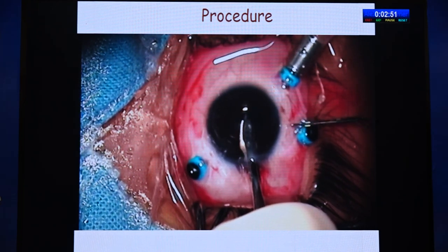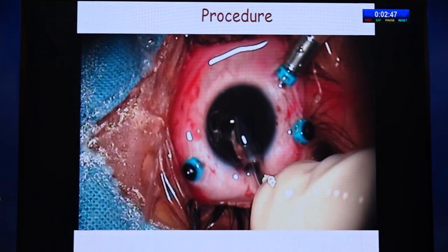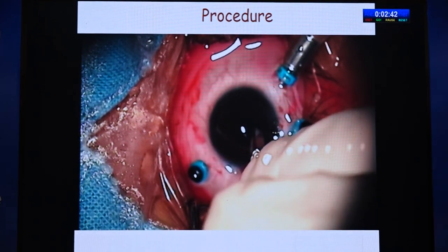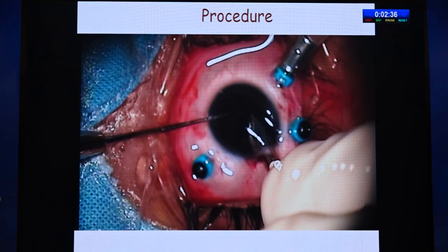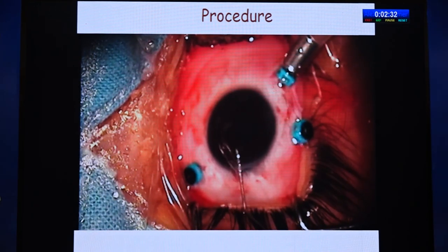Once the IOL is placed, through the side port with the reverse Sinskey you can tuck the iris. Note the direction of how the reverse Sinskey or rod is used — when tucking, it should be in only one direction: one vertical down and out. You should not have an up-and-down movement.